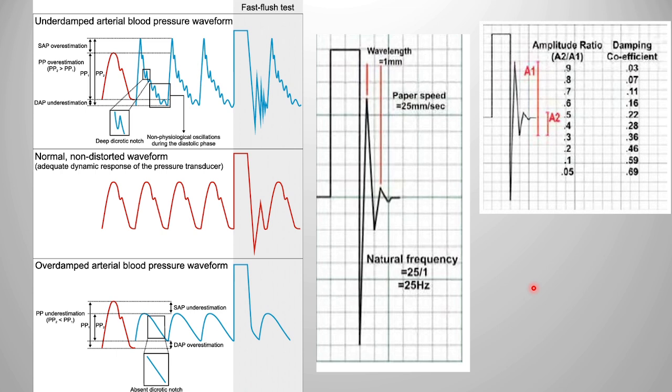So whatever you measure after that will be taken above the atmospheric pressure, and this 760 or whatever we have at your level will be regarded as 0. So leveling and zeroing are important. You should ideally keep checking your leveling and zero after each and every connection, disconnection, sampling, say, for example, change of position, these things.